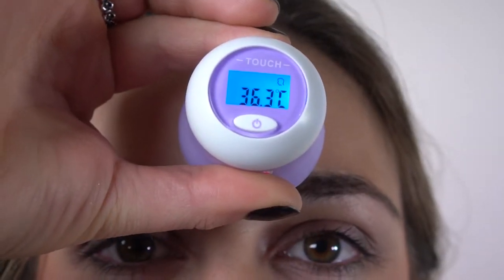Place the thermometer's probe on the forehead. After approximately one second, the thermometer will beep and the temperature will be displayed on a blue backlight.